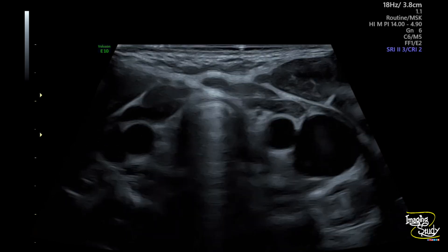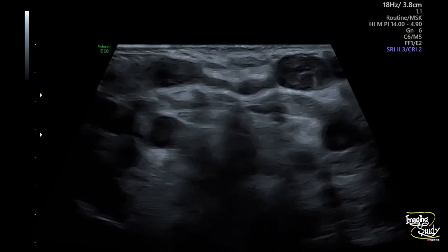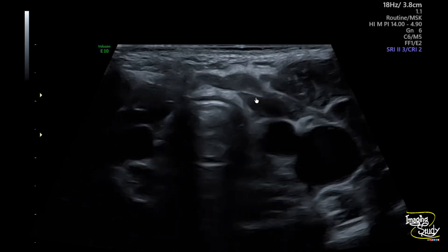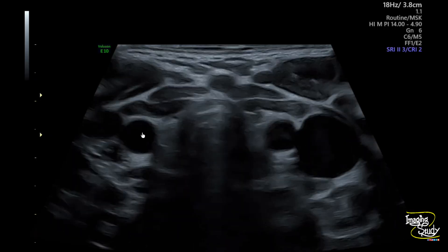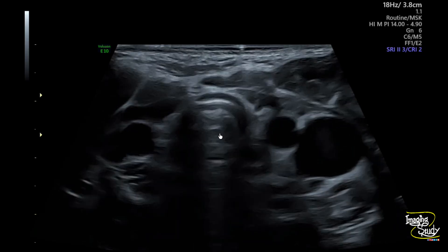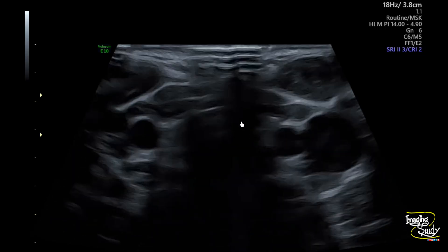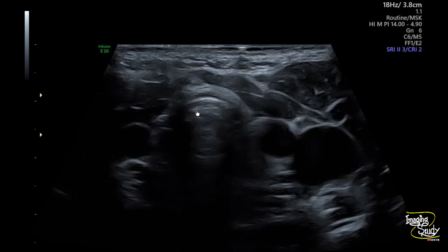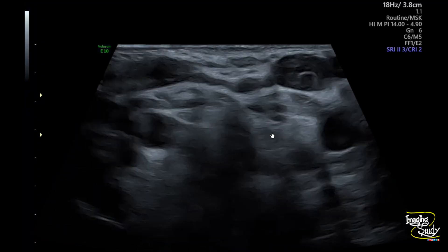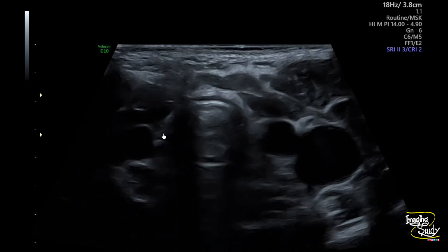On ultrasound, here you can see the high-frequency ultrasound view of the anterior mid-neck on transverse section. There is no detectable thyroid tissue at the thyroid bed. You can see the common carotid arteries, the trachea in the midline, and the strap muscles — with no thyroid parenchyma posterior to these muscles.